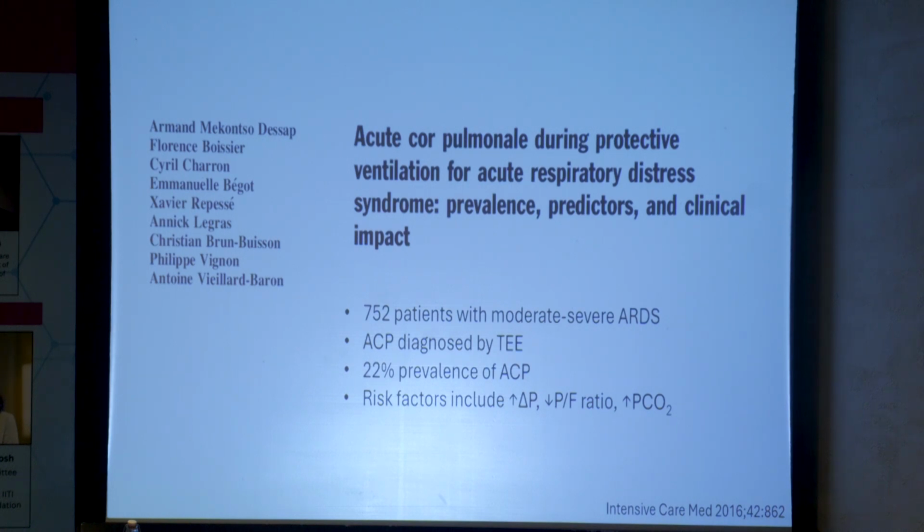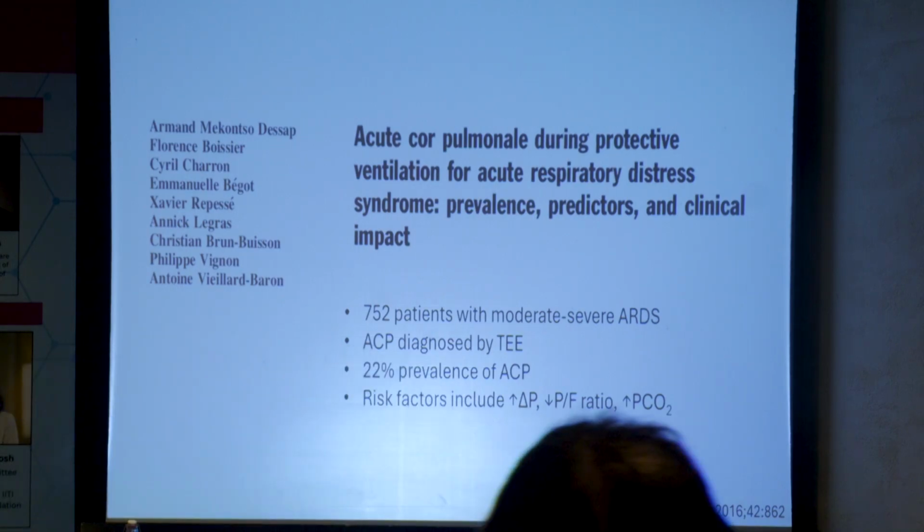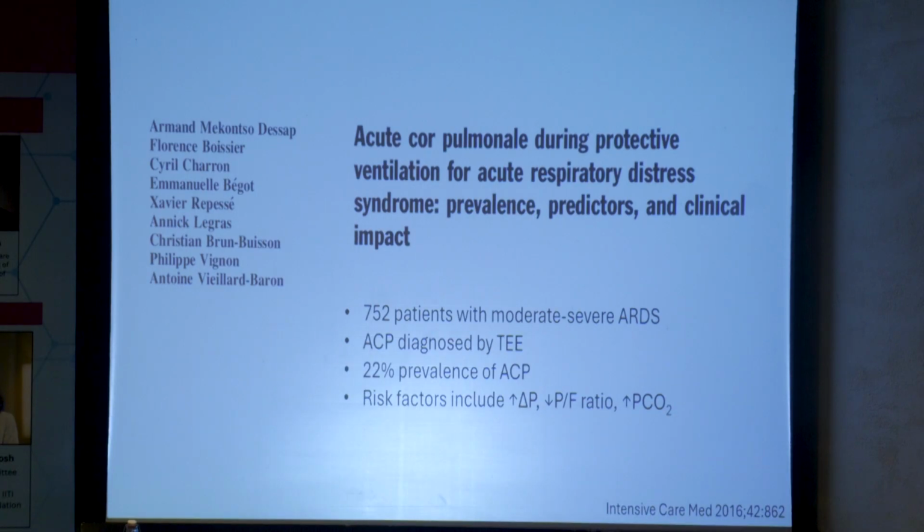In North America, that's not readily available to us, so there have been, as I said, a small number in my career of patients with refractory hypercarbia related to severe asthma or something else who cannot be controlled by other means, and you would consider VV ECMO as a treatment for that because we don't have something in between like extracorporeal CO2 removal outside of a clinical trial. But good question.